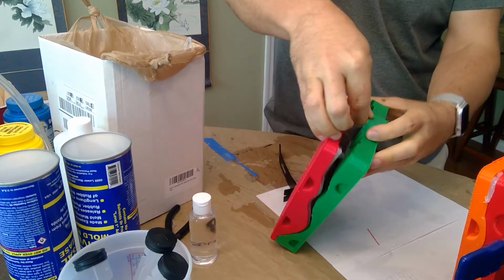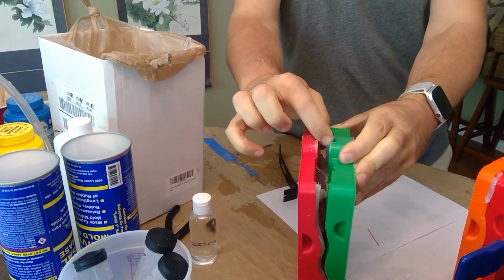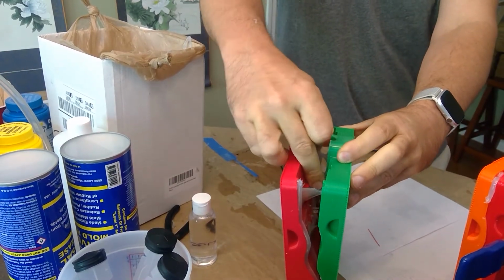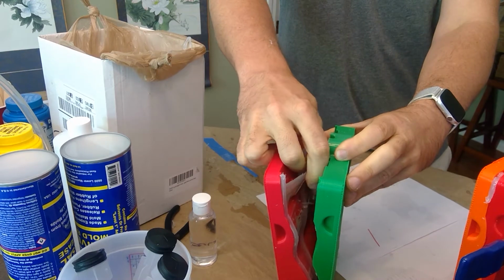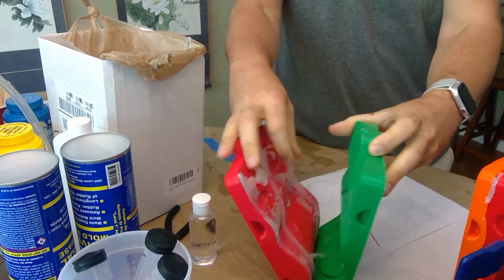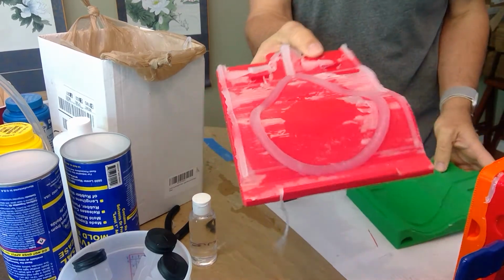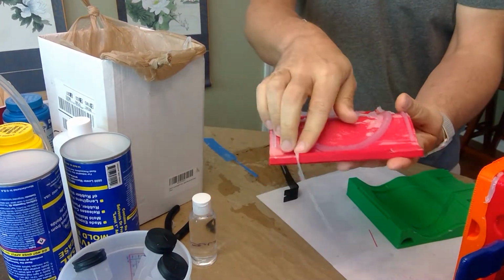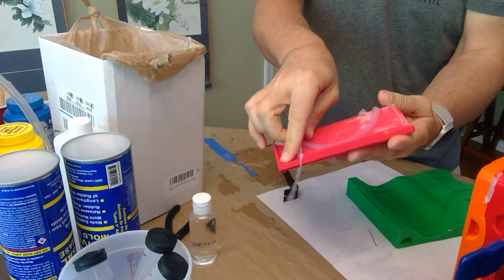Then you reach inside right here. There is that piece that you need to pull off so that it won't break the gasket at the nose bridge. And then you pull everything apart and you're left with a completed gasket. You want to grab that at the bottom to remove it.